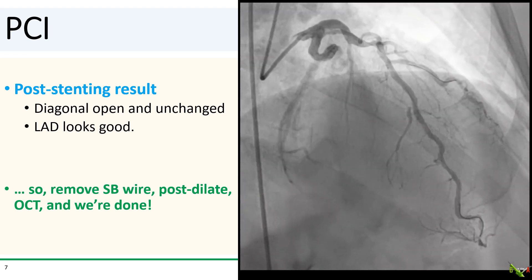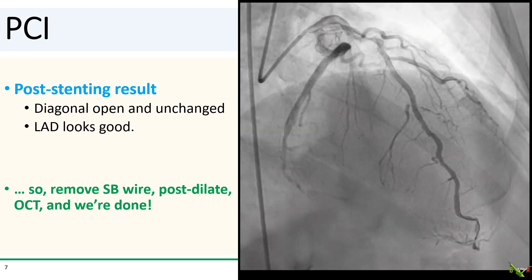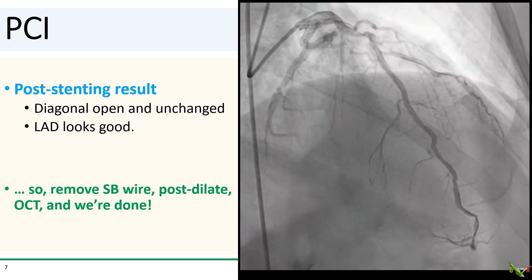Here we are after the stent went in. The diagonal stayed open and pretty much unchanged, and the LAD looks pretty good. So all we had to do now was remove the diagonal wire, post-dilate, do a little OCT, and we'd be home free.